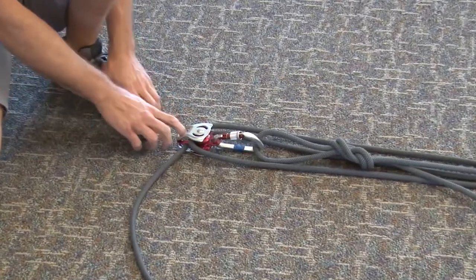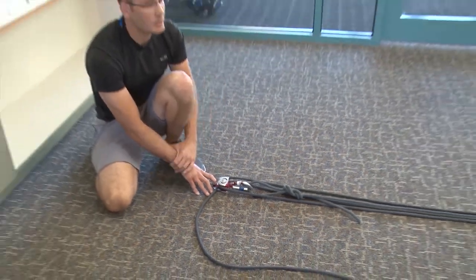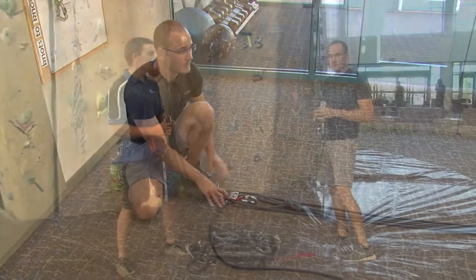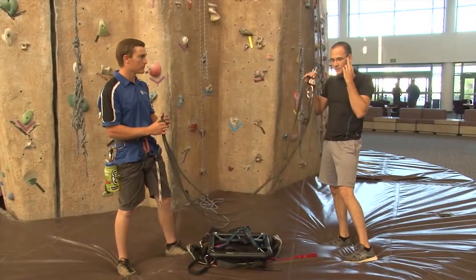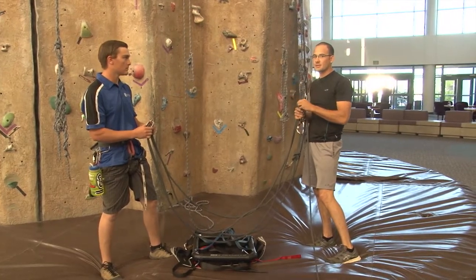Now we have the capability of attaching this to a top rope system in order to belay with the adaptive climbing chair. Now that we have the pulley system put in place, we're going to attach the pulley system to the top rope system.